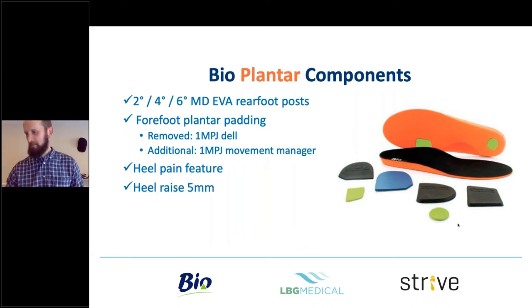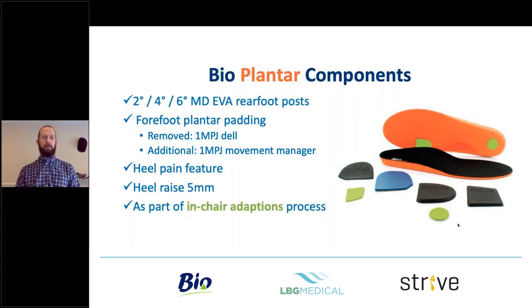The heel raise — a two to five millimeter heel raise — comes as part of the pack. You can stick it on for Achilles problems depending on the movement in the shoe. All of this is part of your in-chair adaptive process, saving clinic time and getting your patient better and out the door quickly.